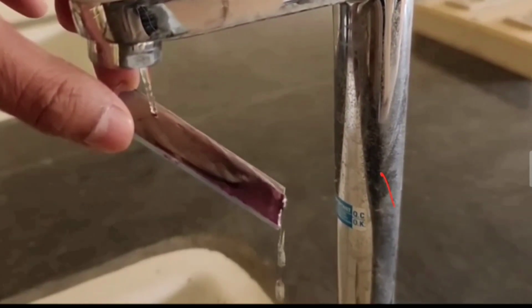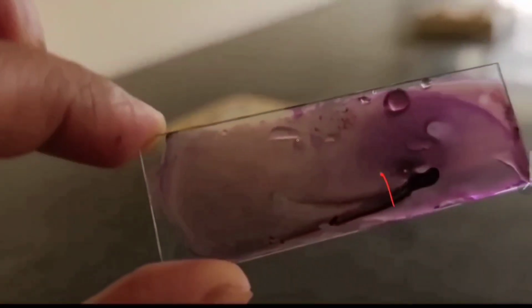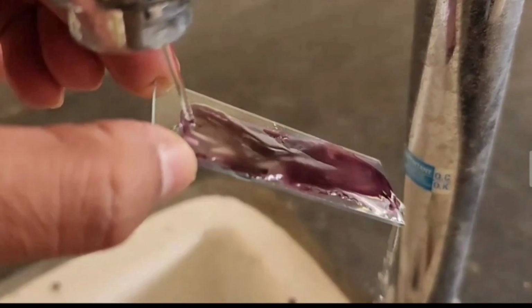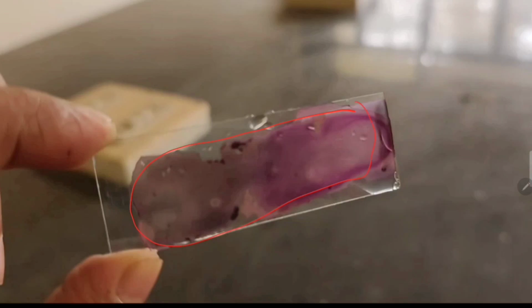It's already almost completely washed, and now it appears slightly pink in color. See, this is actually pink in color. And now I am waiting for it to dry. So this second slide I am going to wash. Again the same procedure, we should completely wash it. Yes, it's already done. This slide is very nice. The color is light pink. So this is a good slide. Wait for it to dry and then we can use this slide.